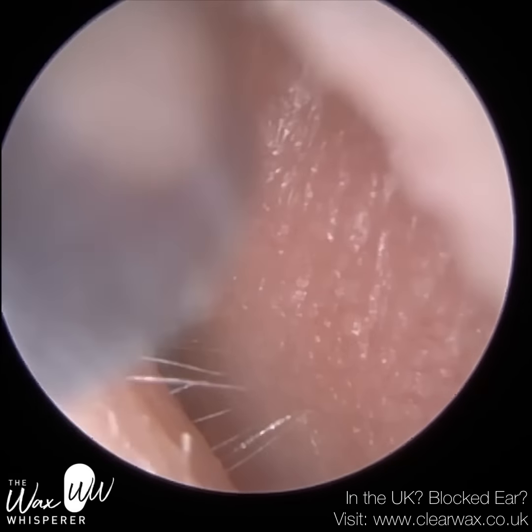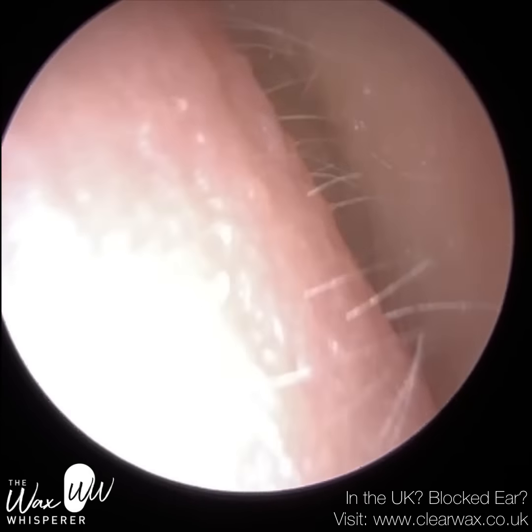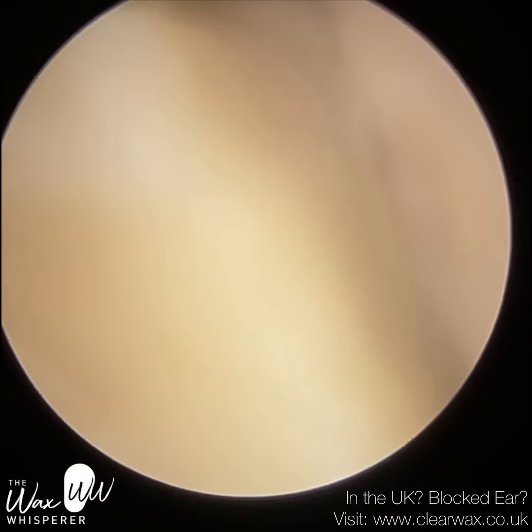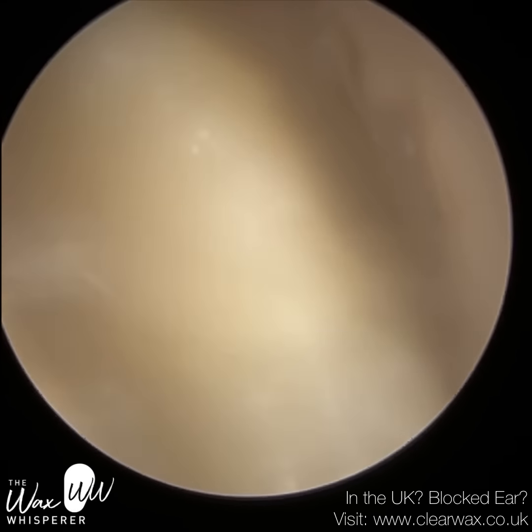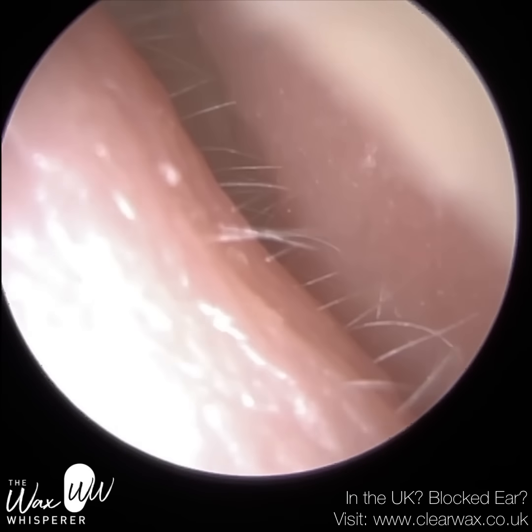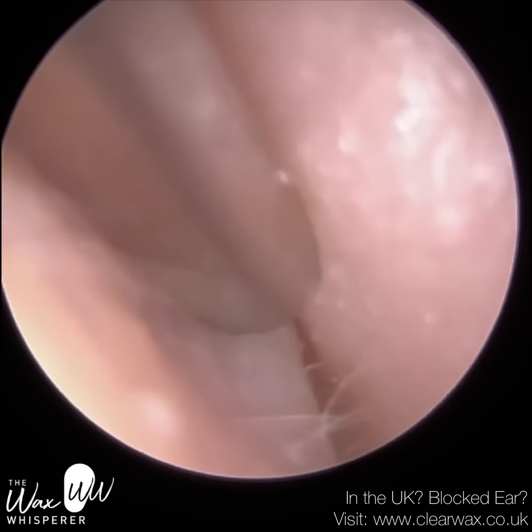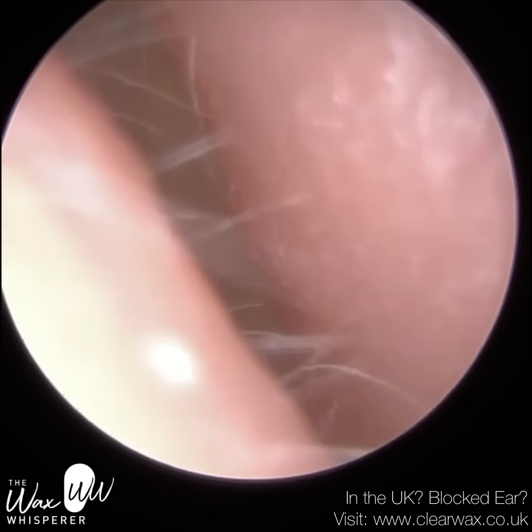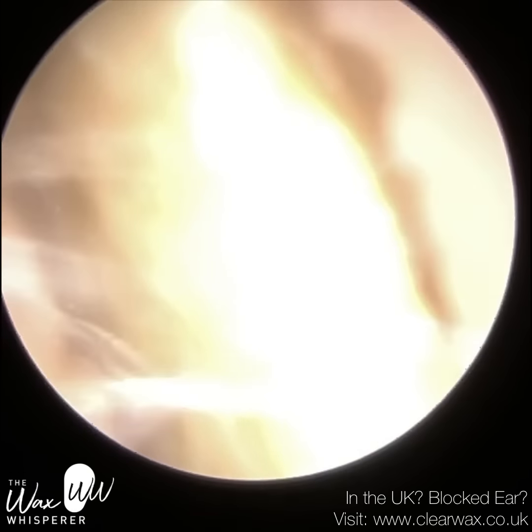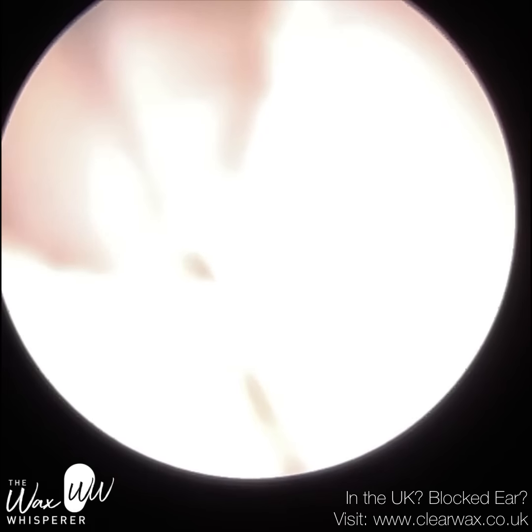We've cleared the patient's left ear — now this is their right ear. As you can see, as I attempt to enter with the suction probe, the ear canal just collapses even more. I'm having to stretch the ear canal wide open, which is why I'm so close to the dead skin plug — the skin plug is right near the entrance. In order to get access I'm having to stretch the ear canal open, and I'm going in with the endoscope a bit later. The idea is to clear up the debris near the entrance, which is also why there's reflection — we're right up against it.